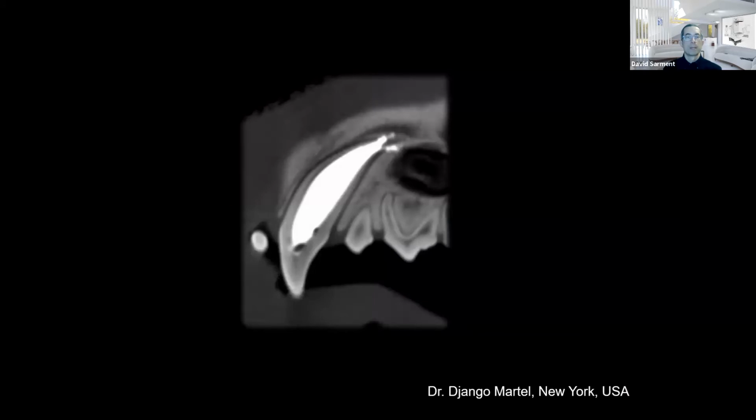Here's an interesting situation with endodontic treatment, where you can evaluate your fill. So this, you could do the imaging before and after, due to the fact that the device is easy to bring over. It doesn't take much to take a second scan right after treatment and see if you're happy with your fill, especially in more complex cases. If there are any sort of voids in your fill, that'll be very obvious to you.